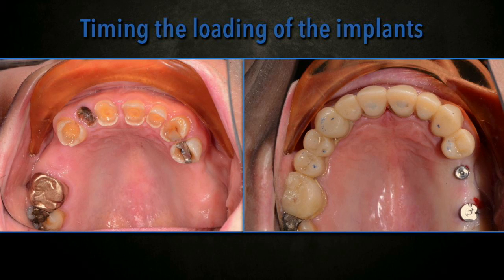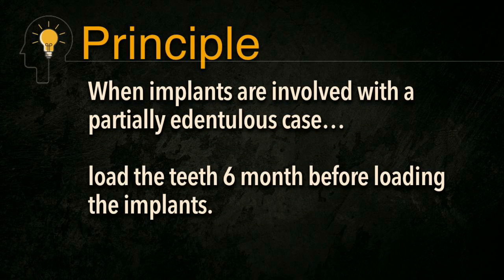So we can go ahead and place the implants at the time of the tooth preparation and crown lengthening. Czyli mamy możliwość wprowadzenia implantów w momencie opracowywania zębów, odbudowania ich koronami, ponieważ te implanty się będą wgajały, nie będą na razie odbudowane. Load the temporaries and then let him adapt about 6 months before we load. Odbudujemy go pracami tymczasowymi, pacjent się będzie adaptował przez jakieś 6 miesięcy, w tym czasie implanty się wgoją.